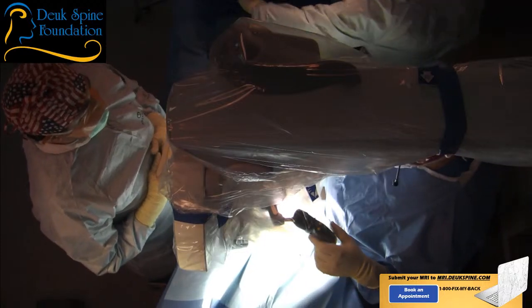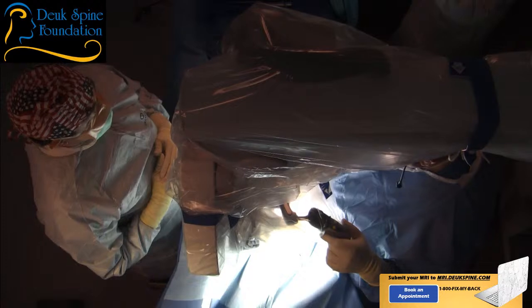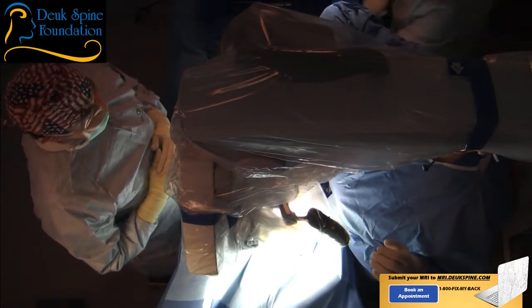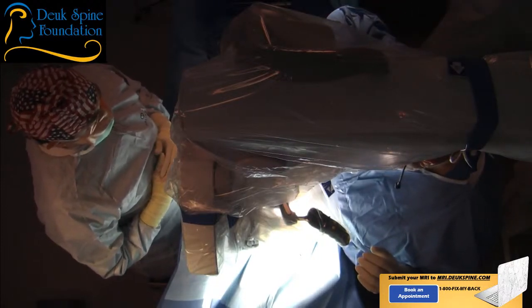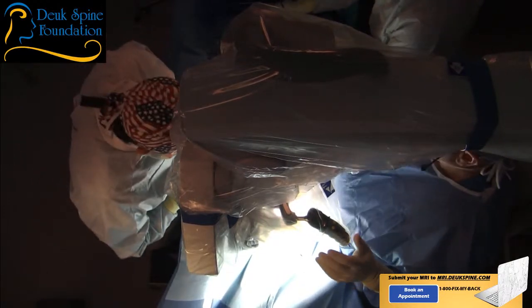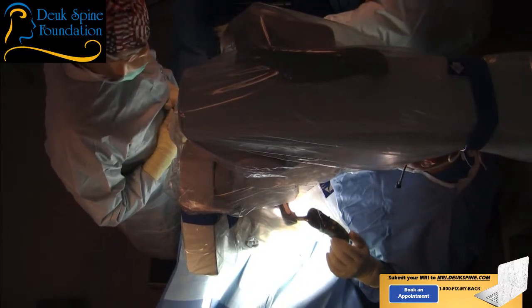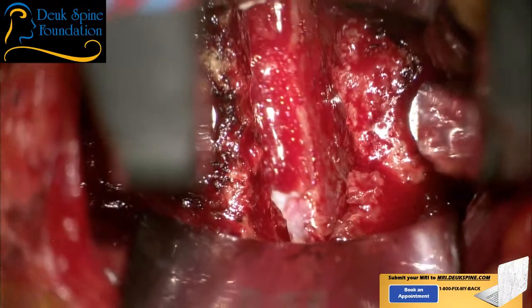I gotta get the microscope set. So watch your eyes, watch your hands. I'm getting the microscope set. Now, before you do anything, Dr. Patel, let me just adjust my interocular distance. Yes, sir. Have we touched the interocular distance at all? No? Okay. Let me just focus it up. Just wait, okay? Wait till I'm done. Because you're going to have to make adjustments after I make adjustments.